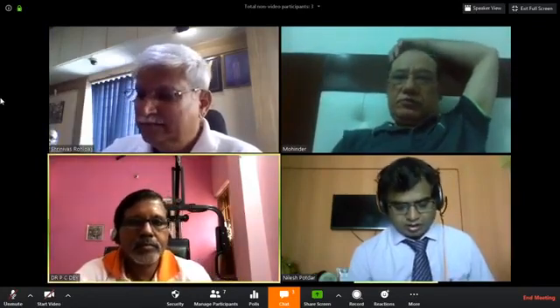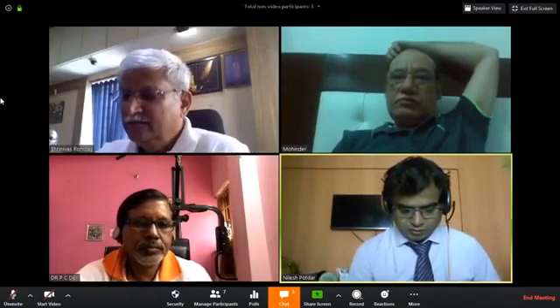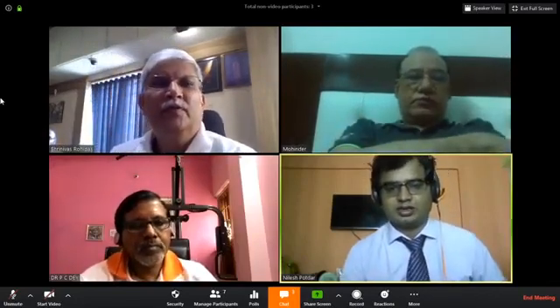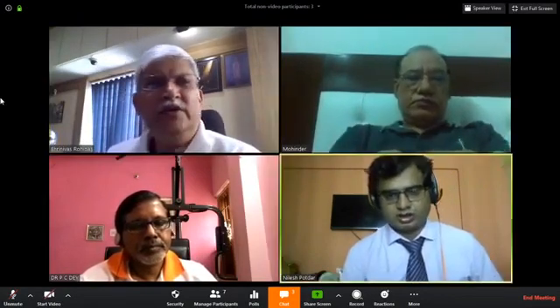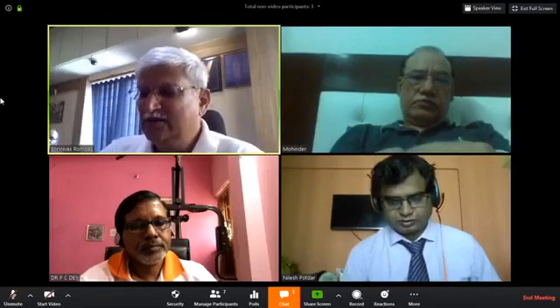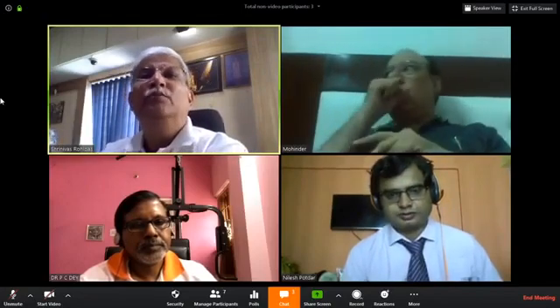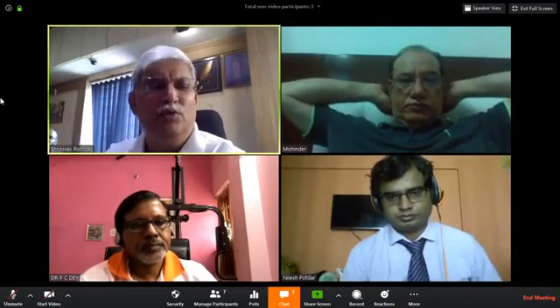Sir, this is a question from Dr. Shirke from Kolhapur. He is asking, is it possible to do it under regional anesthesia? What is your own or anybody's experience? Any one of you can answer this question one by one. First I will answer, then we'll go to Mohinder. Yes, we tried doing it in spinal and some local. We have done 5 cases in local, but the patient is uncomfortable. In spinal, I think the muscle relaxation is not adequate. So I usually prefer GA, but Mohinder always does it in spinal. Dr. Destandau does it in spinal and GA both.